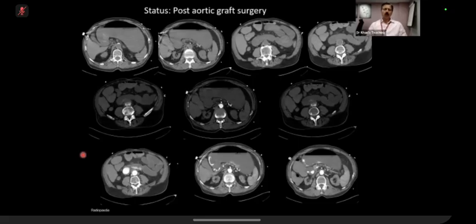You know, aortoduodenal fistula. This is a very important exam case. Aortoduodenal. Previous one was a spontaneously bleeding ulcer, so that was different, right? GI bleed. This is different. Here, there will be a story. The story will be that the patient might have had some grafting of the aorta as an aneurysm, and then has developed infection. So there might be stigmata of infection. And with that, there might be stigmata of active bleed.